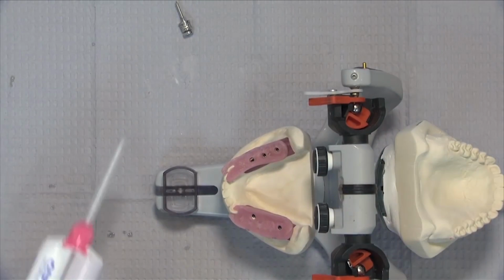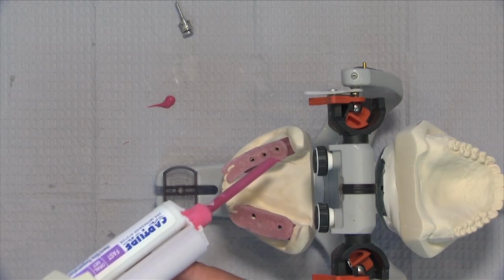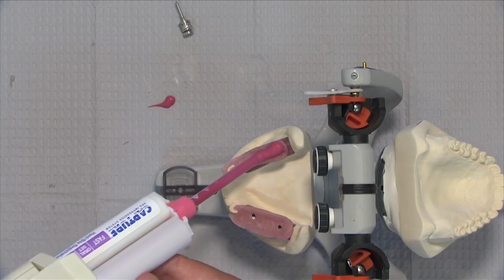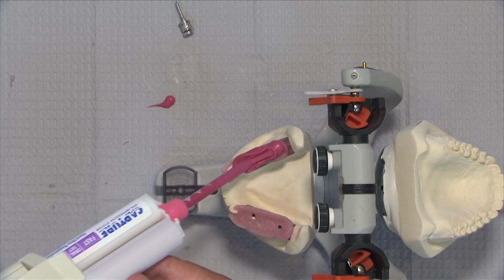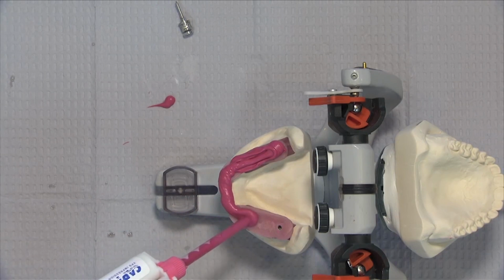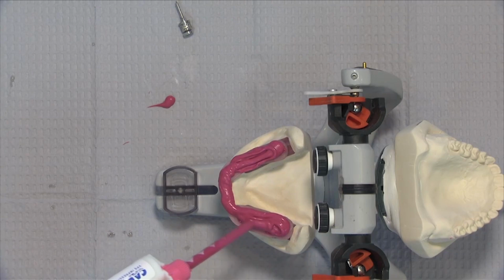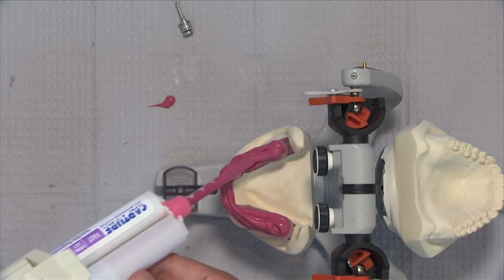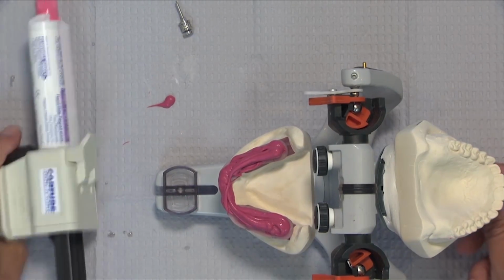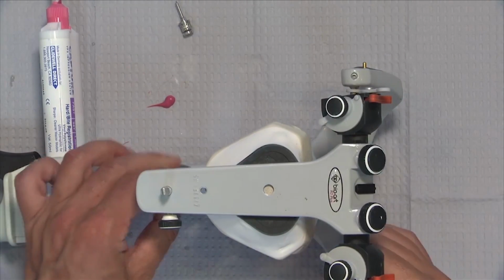Any polyvinyl siloxane bite registration material happens to stick very well to the light cured guide itself. So there's no reason to put any kind of bonding agent here. This is going to stick to it. In fact, it's very difficult to get it off if you ever wanted to get it off. If you wanted to take it off in your office and do the bite for a second time, you'll see you need to get a scalpel out and really go through a little bit of work to do this.